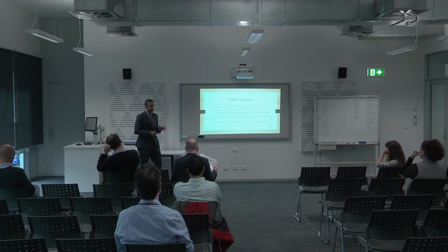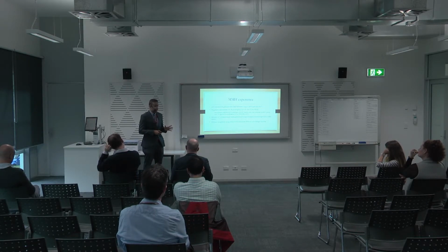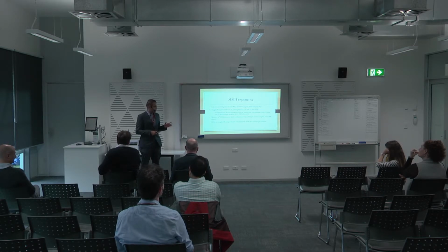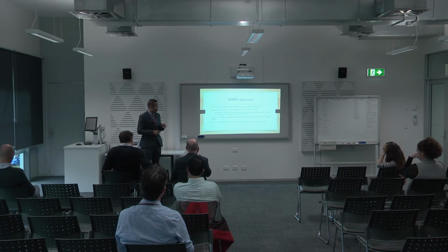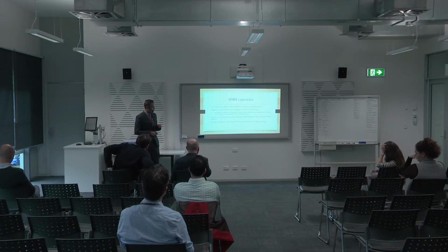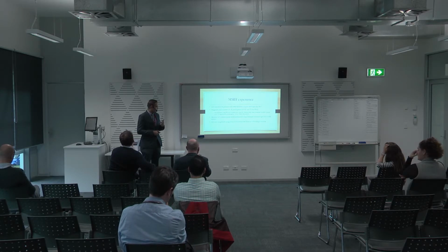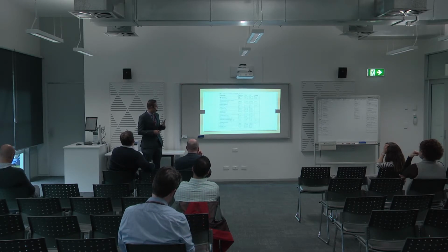Okay, now I want to come to my study. We have no local data thus far which looked at chromoendoscopy, so we thought we'd have a look. We investigated 110 consecutive patients between the specified time period and compared patients who had chromoendoscopy versus white light endoscopy. So we had 35 patients who had chromoendoscopy and 70 white light. We sat with our statistician and we used the Poisson model here. So these numbers gave us enough power. We used Olympus, and as mentioned, methylene blue or indigo carmine was used.